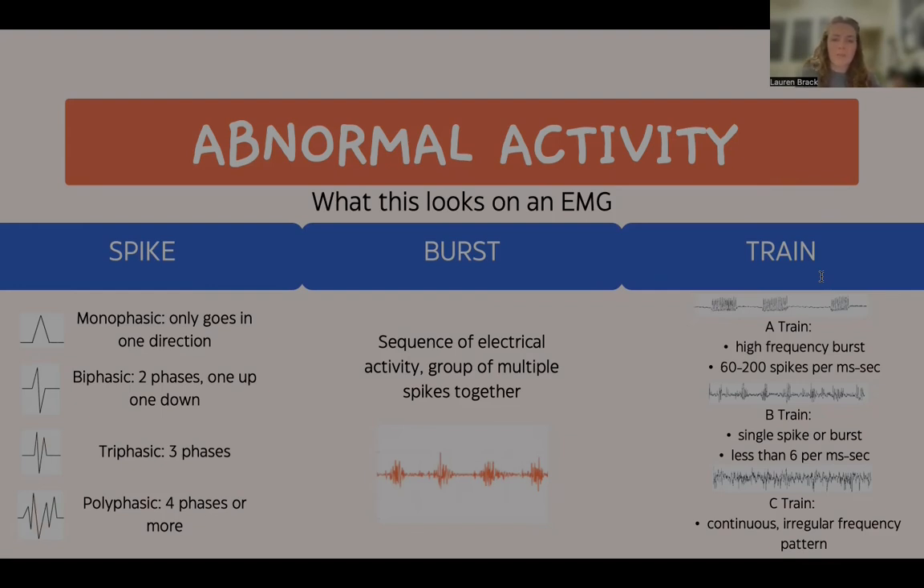Bursts are a series of rapid, repetitive discharges of electrical activity that occur in a sequence — a group of multiple spikes together. Bursts can be triggered by mechanical irritation of the nerve; for instance, if the nerve is accidentally bumped or touched during the procedure.